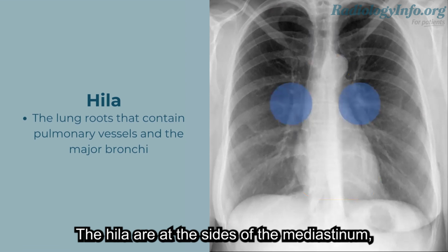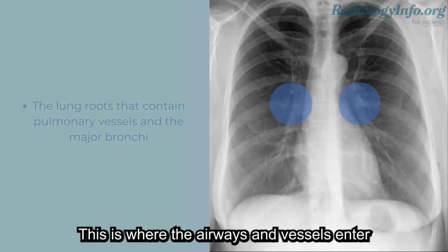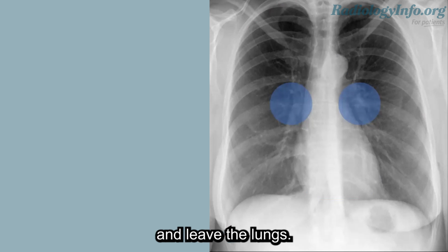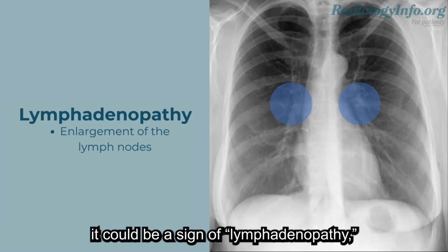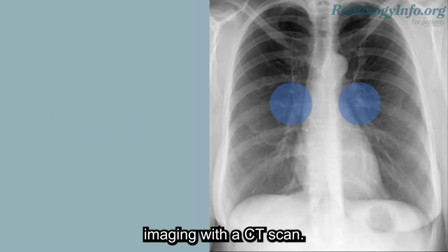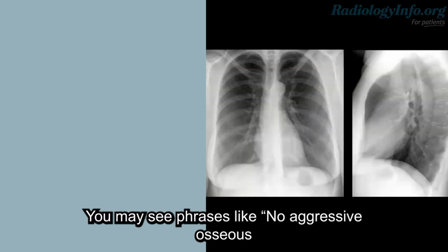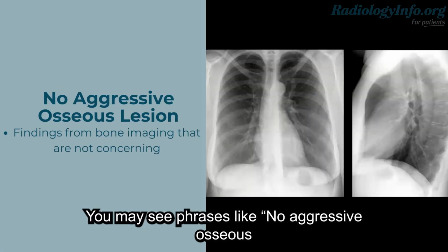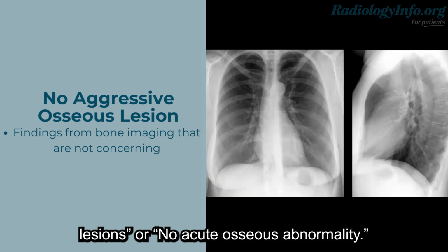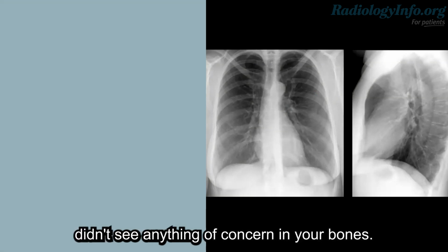The hila are at the sides of the mediastinum, highlighted here in blue. This is where the airways and vessels enter and leave the lungs. If they look enlarged, it could be a sign of lymphadenopathy, enlarged lymph nodes, which would warrant further imaging with a CT scan. Your bones are also visible on the chest x-ray. You may see phrases like no aggressive osseous lesions or no acute osseous abnormality. This simply means the radiologist didn't see anything of concern in your bones.